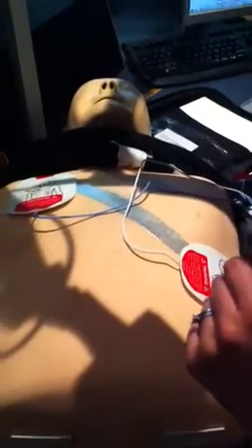When the first pad is in place, now peel the second pad. Place pad exactly as shown. Further down, under the chest. Press. There we go. Stay clear of patient. Okay. What it's doing, analysing heart rhythm. It's checking to see what the heart's doing and whether it needs to give a shock.